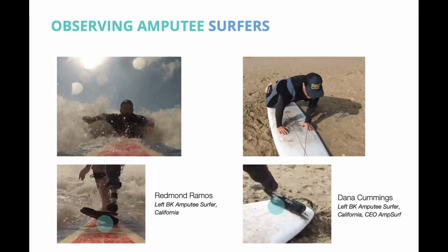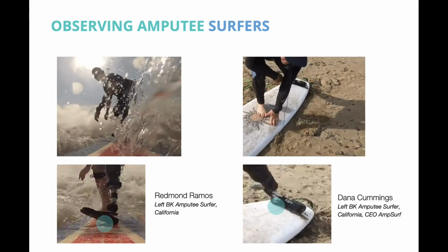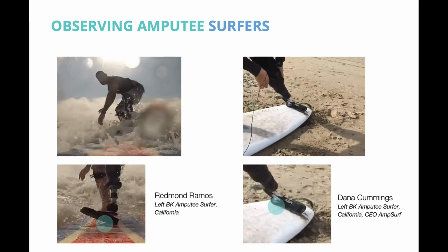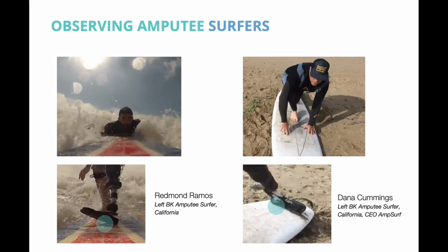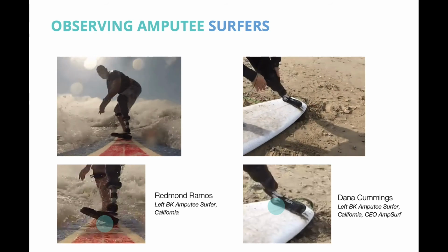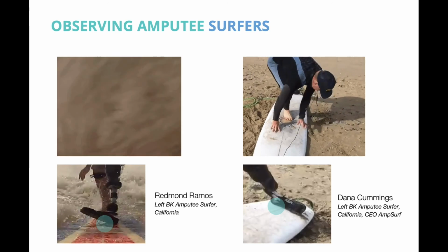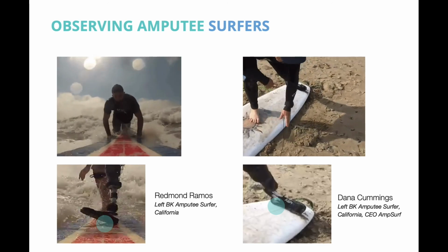We observed many amputee surfers from the West Coast and noticed the current feet they have don't adapt to the sport as well as they should. It is difficult to balance on the board when surfing because of lack of adduction foot motion, and very little flexion to the toe and grip on the bottom makes it impossible to do a proper pop-up.